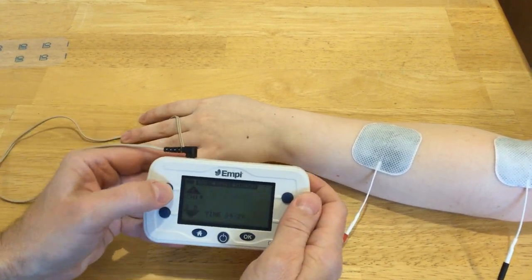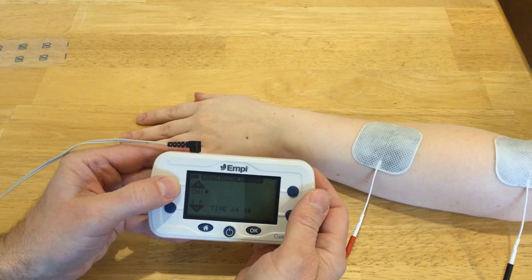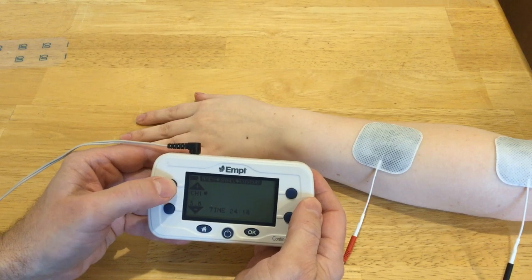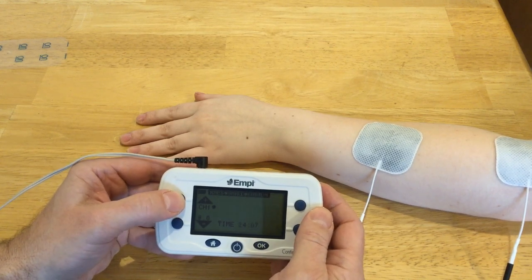I'm slowly going to increase my intensity again. She's got the sensory response going, and we'll probably have to go up to the mid-teens or so to get a motor response.